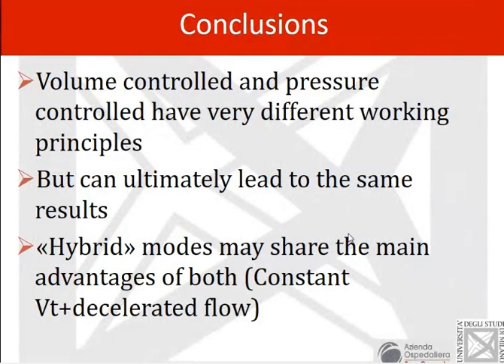So, going to conclusion, I think that volume control and pressure control make a huge difference for us doctors managing the ventilator, but perhaps if the tidal volume is the same and minute ventilation is the same, they will lead to similar results in terms of CO2 elimination and oxygenation and ventilator-induced lung injury. Perhaps we could have hybrid modes that could share the advantages of both, so a constant tidal volume and a decelerated flow.